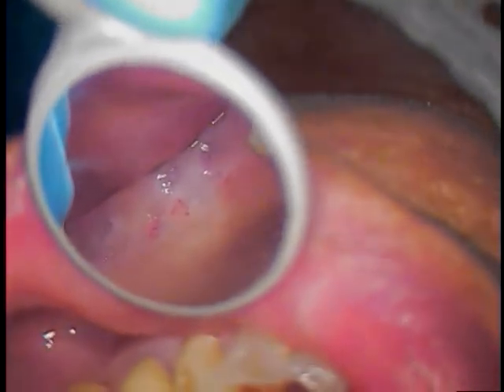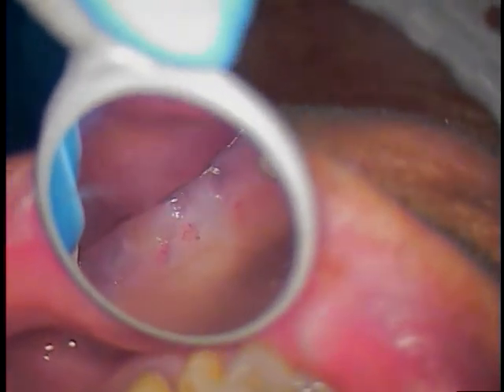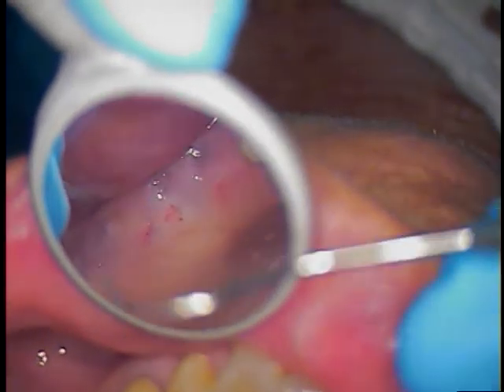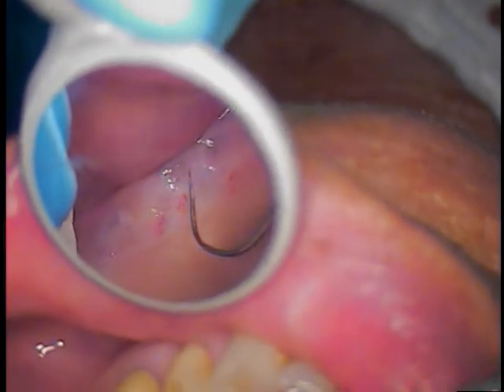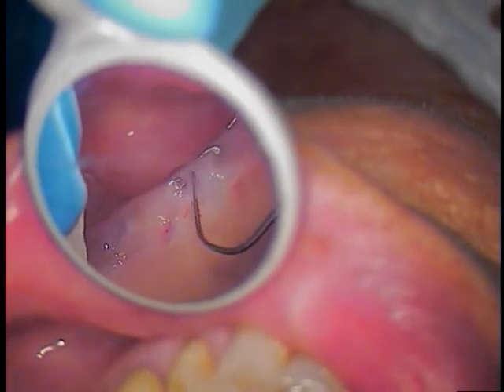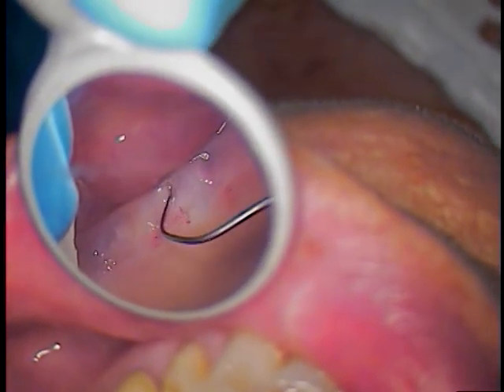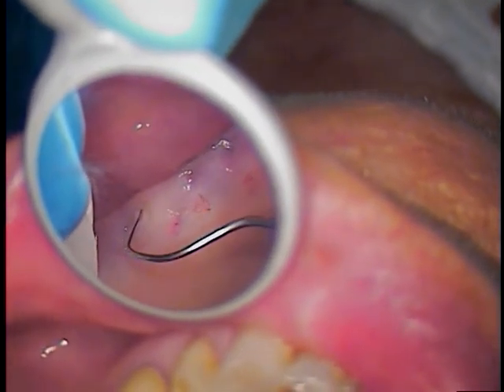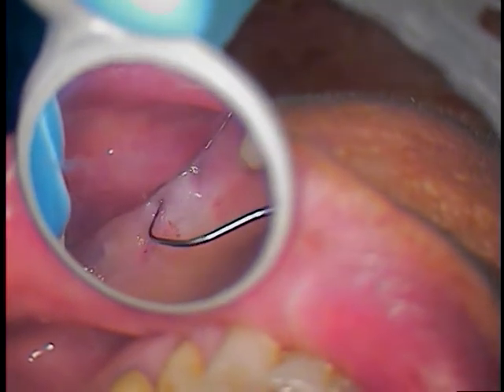This case has been in her mouth probably for about 30 years. It's initially thought of as a Branemark case, but we'll find out exactly what kind it is. So we have the three implant fixtures that are subgingival right now, below the level of tissue. I can just feel the tops of the fixtures themselves, so we know approximately where they are.